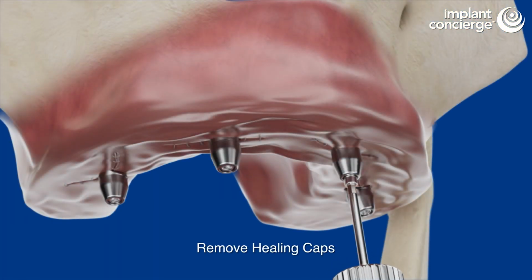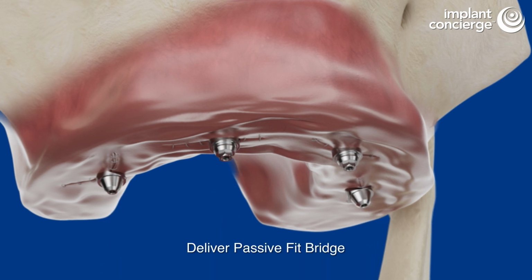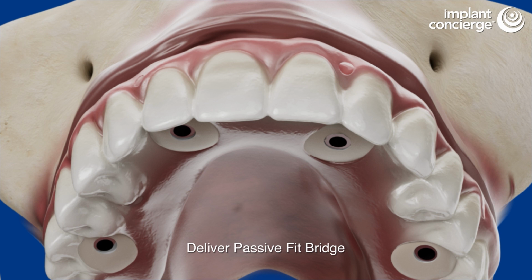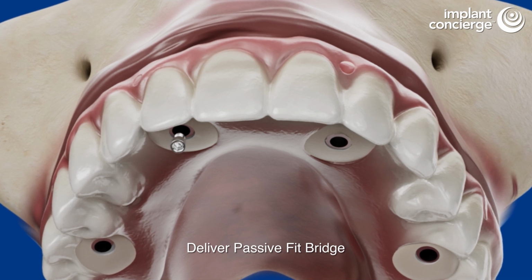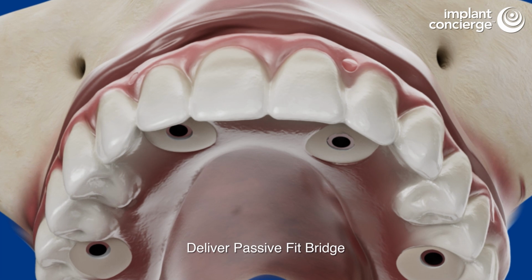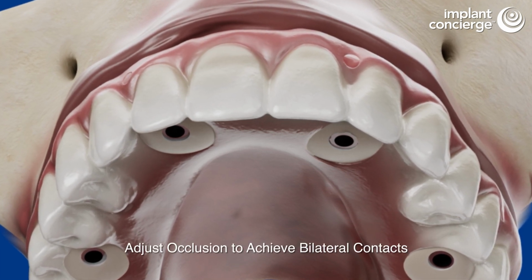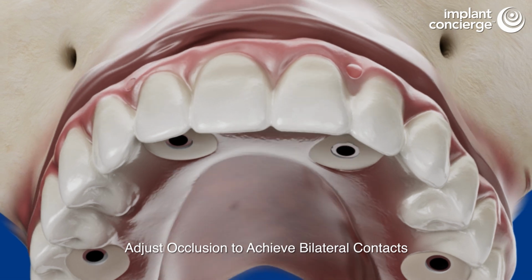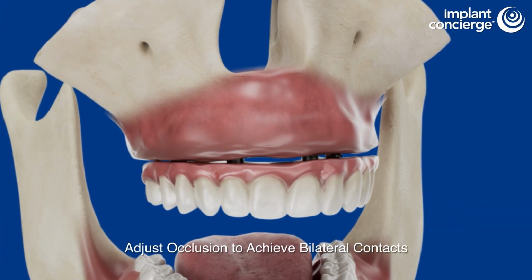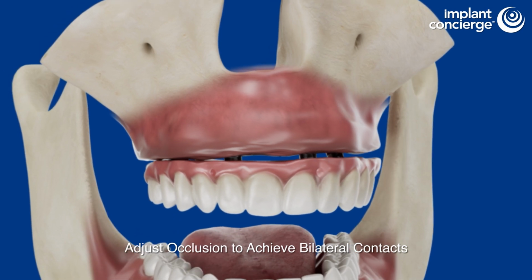Remove the healing caps and seat the passive fit bridge onto the multi-unit abutments, ensuring no tissue is trapped. Initially, hand tighten each prosthetic screw in a star pattern, and then tighten it according to the manufacturer's torque recommendation. Check to ensure no acrylic is interfering with the desired occlusion. Adjust the occlusion to achieve bilateral contacts. Fill in the screw access holes with cotton and material of choice.